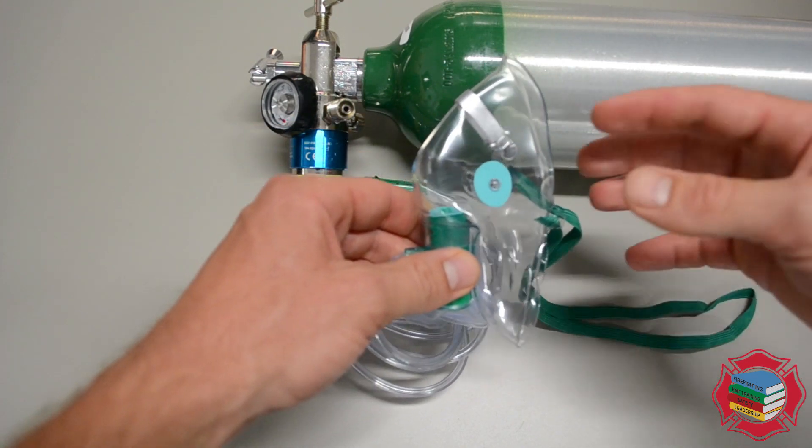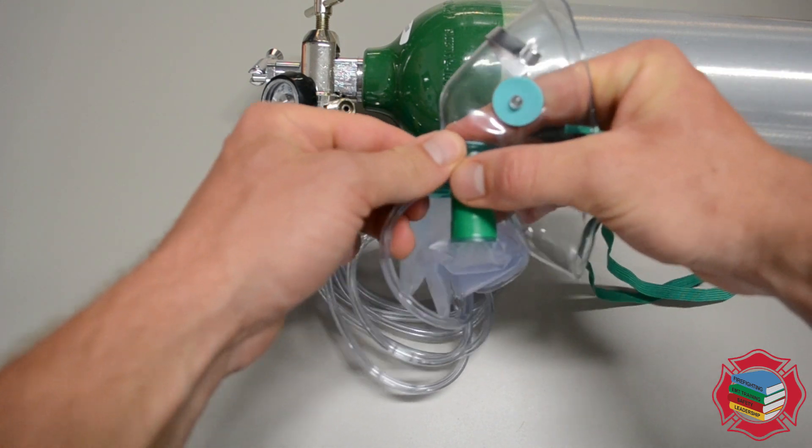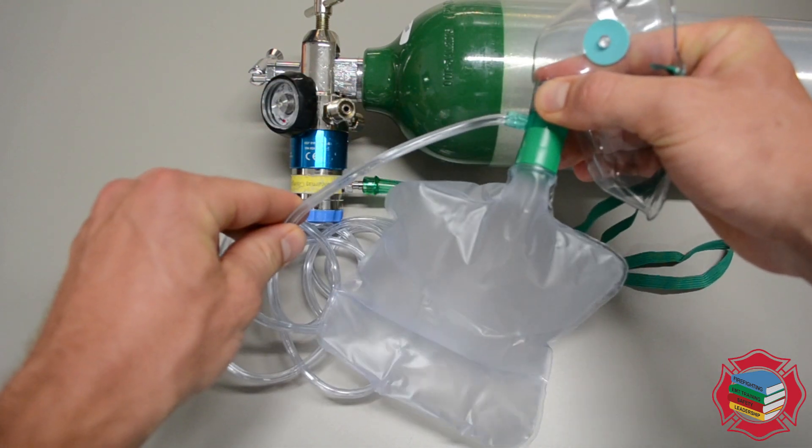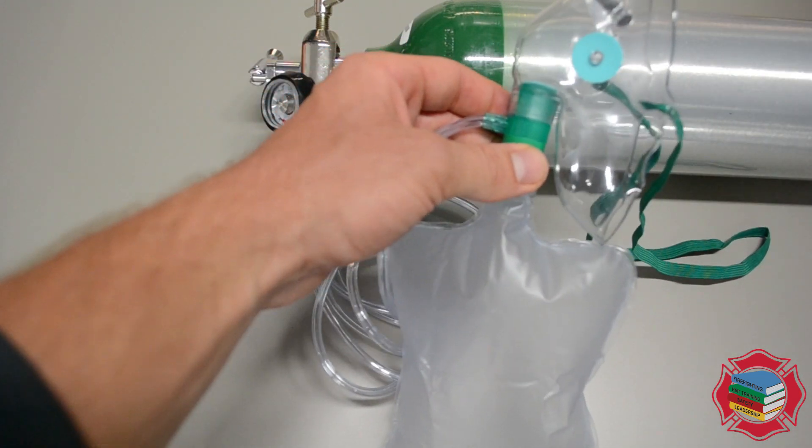Obviously I'd be wearing gloves if I was out in the field, but I'll open up the interior of the mask and place my finger here to inflate the reservoir bag. You want to be careful you don't pop it, so I'll let go right there.